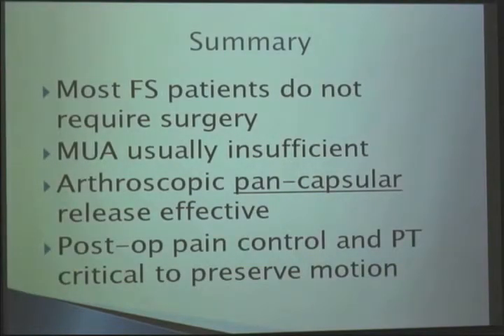So in summary, most of these patients do not require surgery. Manipulation, I think, is insufficient, but is a component of the procedure that involves a pancapsular release, and I think your postoperative pain control is critical for you to be able to preserve the motion you get.